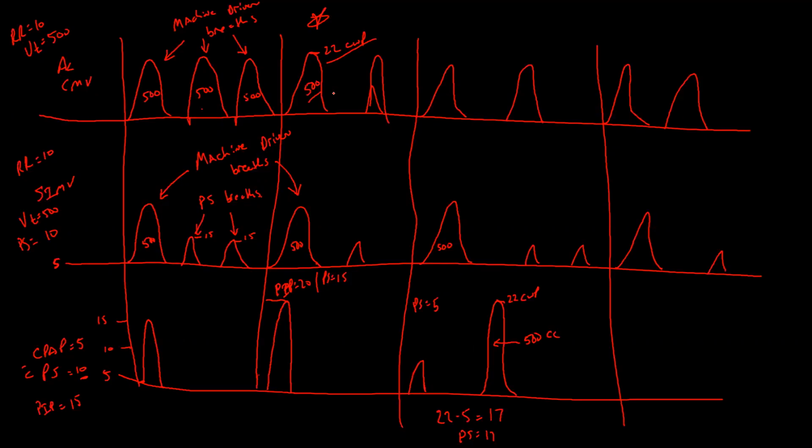On the test, I believe it says peak pressure for your TMC exam instead of PIP. But just know that there are specific pressures involved. That's why at the beginning, I try to emphasize the difference between PEEP, peak inspiratory pressure, and plateau pressure, because there are a lot of different pressures we're talking about, and we need to make sure that we know the differences and how they relate with each other and whatnot.